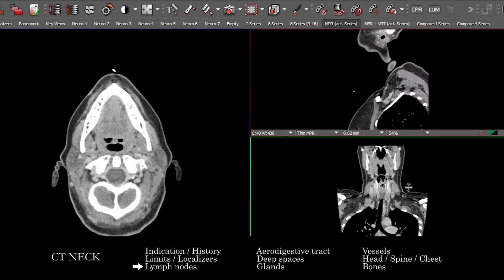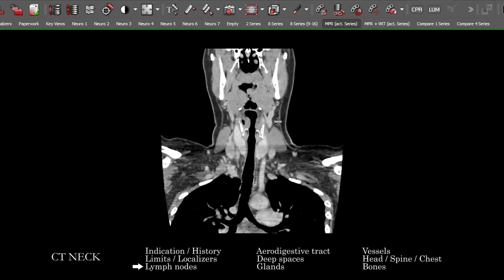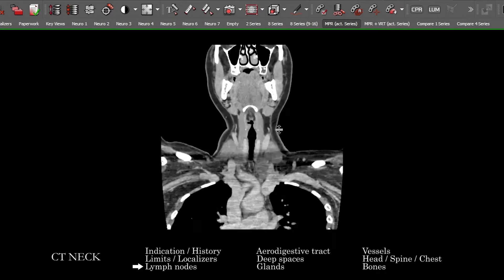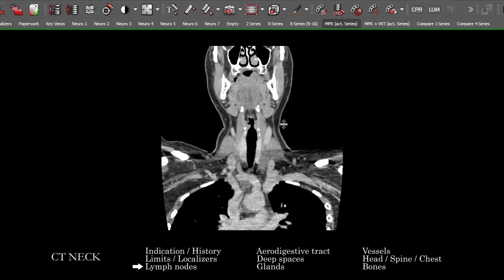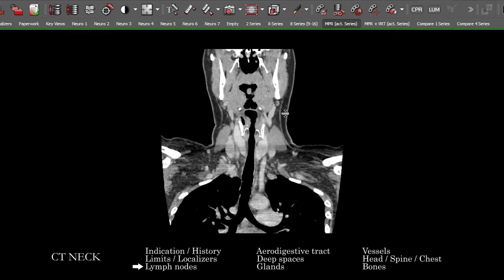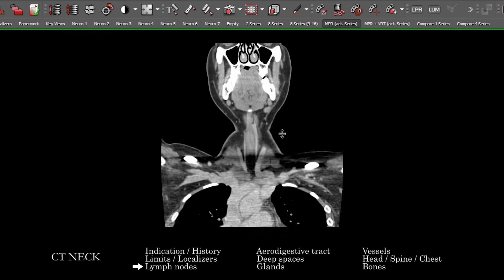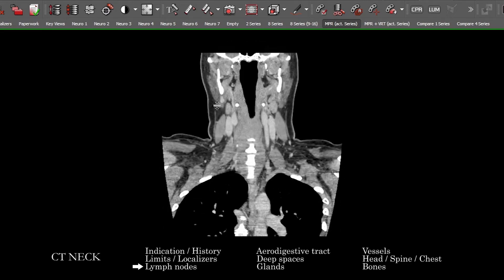Usually what I like to do first is start with that outside look at the potential lymph node distribution, looking for abnormal adenopathy or mass lesions in the neck, confluent inflammatory change, any sort of soft tissue abnormality, inclusive also of collections, or anything disrupting normal fat planes and muscular tissue planes.